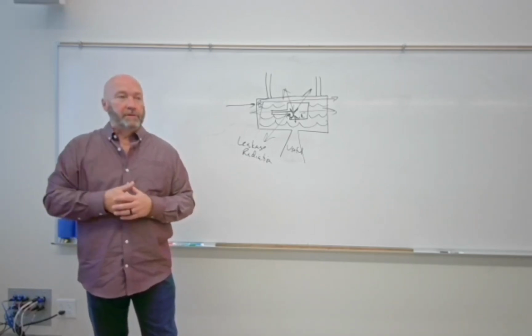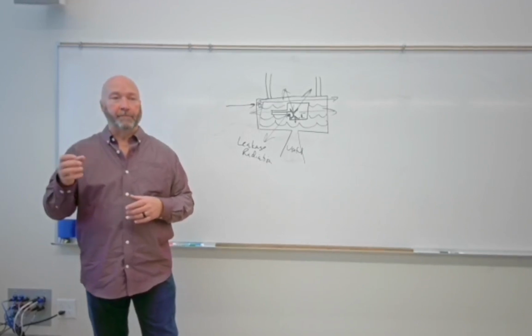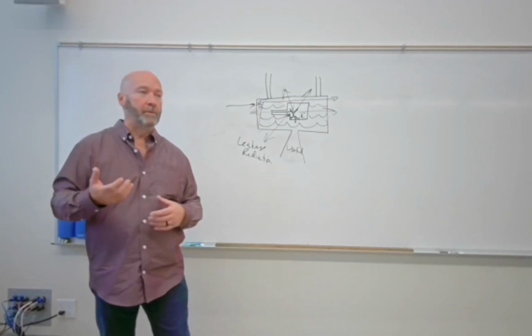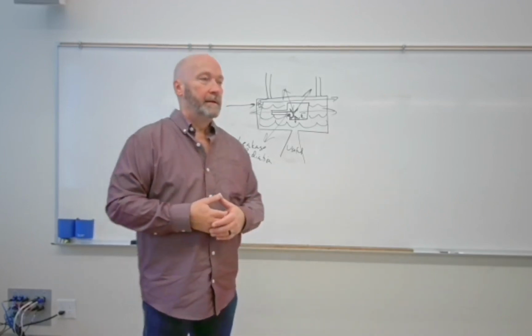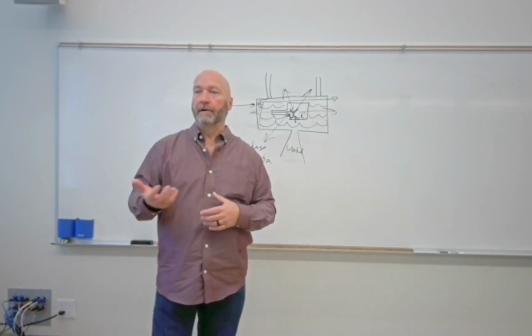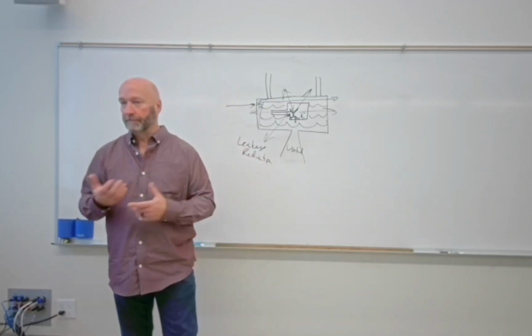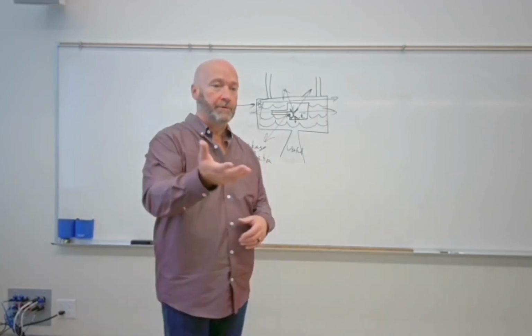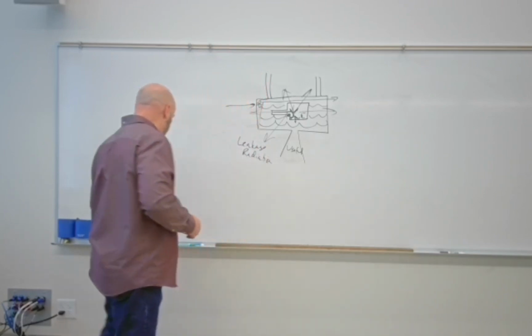We can lose part or all of that vacuum, and what happens is we get vaporization of whatever gets inside of there, and what we then have is what we refer to as a gassy tube, and we get erratic exposures that are unpredictable. So maintaining that vacuum is very, very important, and that's what glass does. Sometimes we'll use a metal envelope instead of a glass envelope. And here's why.